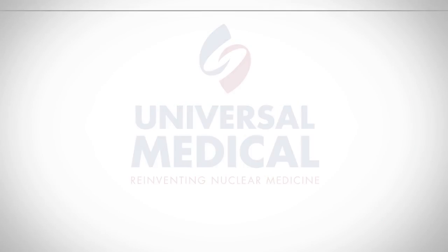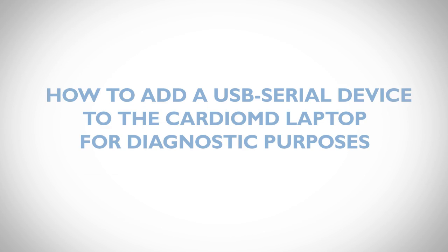In this video, we will be discussing how to configure the CardioMD acquisition station with a USB to serial device, which will allow us to use the CardioMD laptop to flash EDCs or motor controllers and to provide other diagnostic abilities.